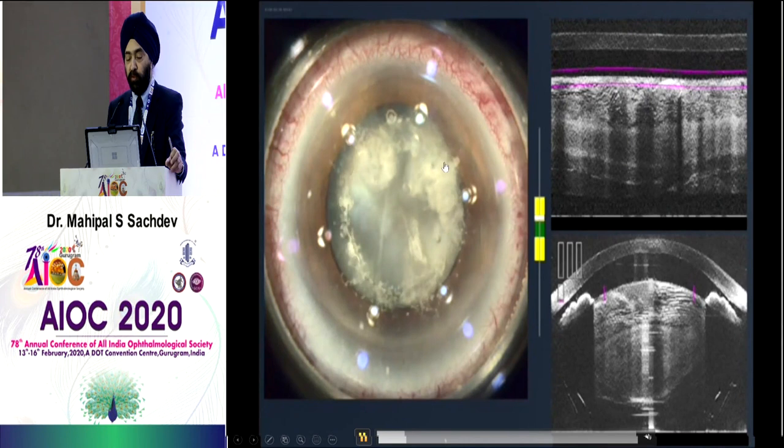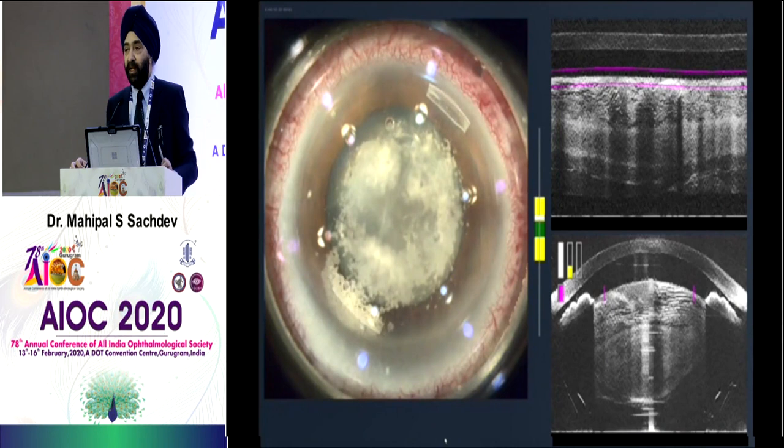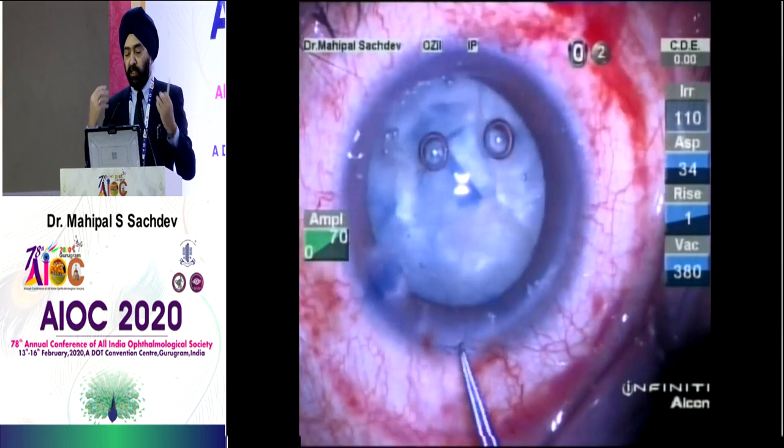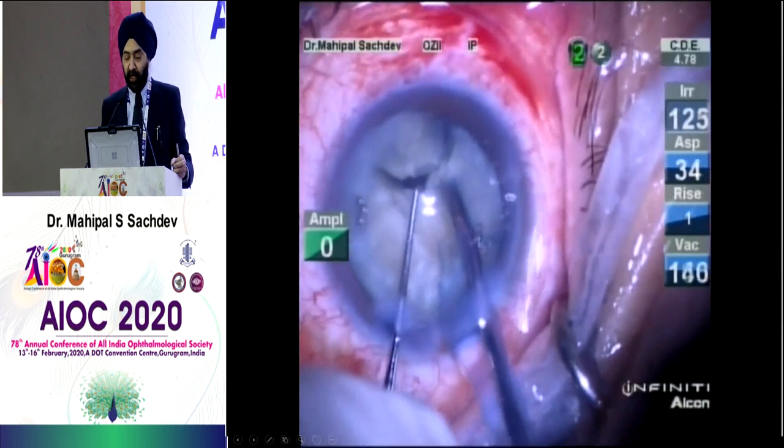Can you see that huge amount of explosion? This is what the intralenticular pressure causes in cases that you are doing with a needle. Now, these are just incisions. I'll go forward. So if you see here, again, always use trypan blue, because when this intralenticular fluid comes out, it can have some areas of skip. So you see, I get a fantastic capsulotomy.